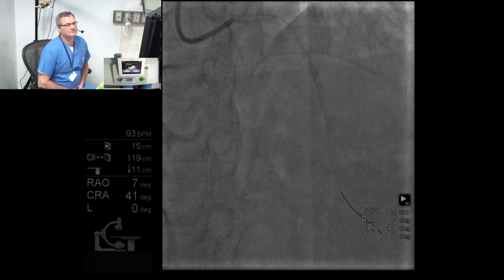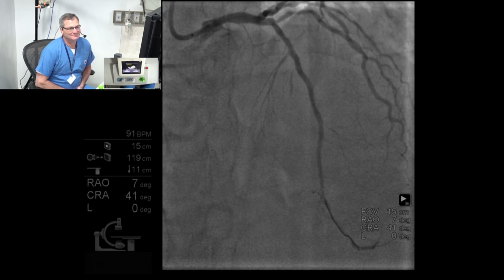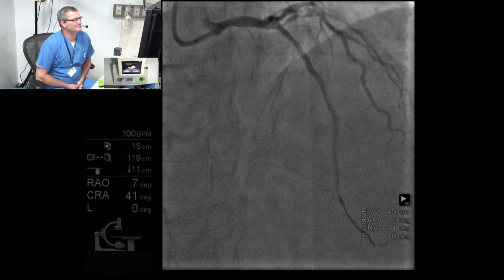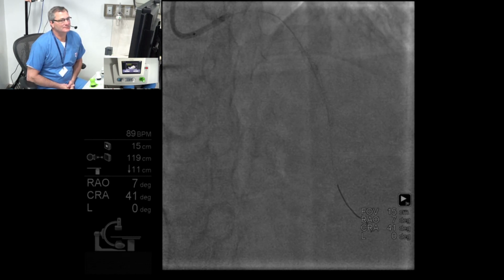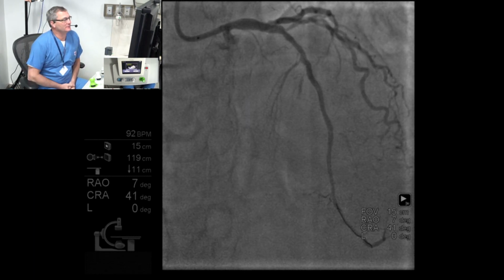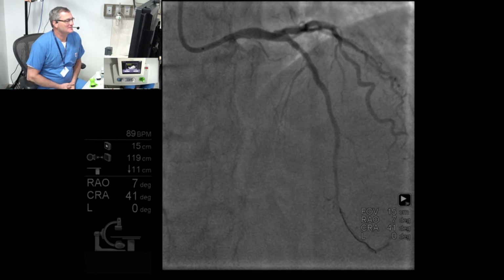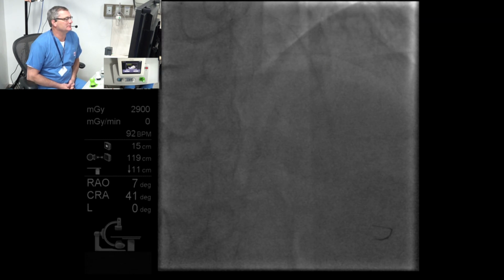You know, Aaron, you and I were talking about vessel size here, and I thought 2.25 seemed too small. At 2.5, we thought that was a bit of a compromise. But you may or may not have noticed, I've just seen there, the field of view is 15 centimeters. Yeah. And I think that's maybe what's fooling us. We're working on zero magnification. I think that's part of it. I'll take that excuse, Malcolm. But the OCT doesn't lie. It was 2.0 in the distal reference segment. And so actually Aaron, we have a nice little step down on the distal edge of the stent.